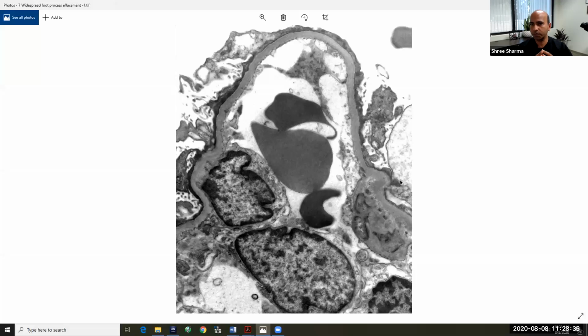Therapy-wise, once you have made a diagnosis and you start treating your patient depending on the type of FSGS, if you are not getting a response, then we should think about genetic variants of FSGS. Morphology-wise, there are no strong indicators. If there is a collagen abnormality, you will see abnormalities of the GBM. You will see lamellation, you will see basket weaving. If there is a collagen mutation, you will end up seeing abnormalities of the GBM. But you won't see a lot of hints of genetic mutations on the biopsy, except for a few.